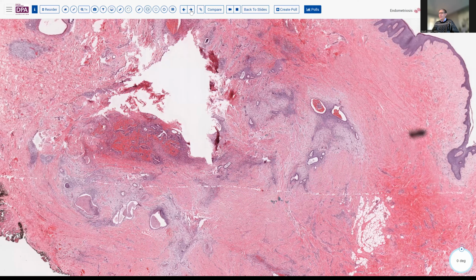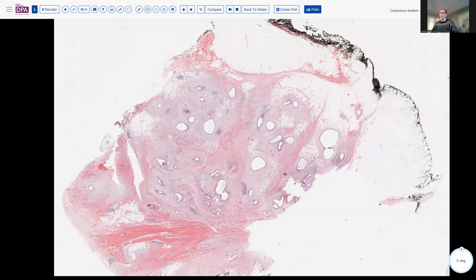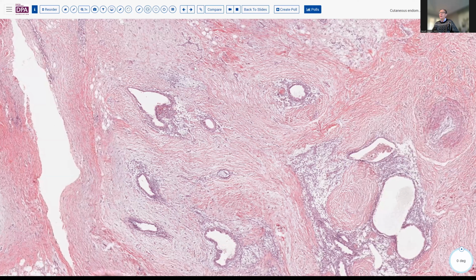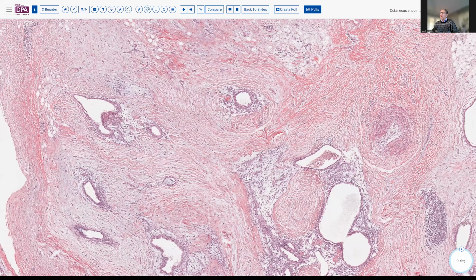Now we illustrated an example also where there is relatively little stroma, but a lot of other types of stromal reaction. Here in the peritonealized surfaces, you can see these glandular spaces with a real minimal amount of stroma, but a lot of desmoplastic reaction. This might easily mimic cancer, particularly if you had some degree of atypia, but the association of the stroma, the hemorrhage, and the usually quite bland cytologic features should help you to exclude metastatic neoplasia.